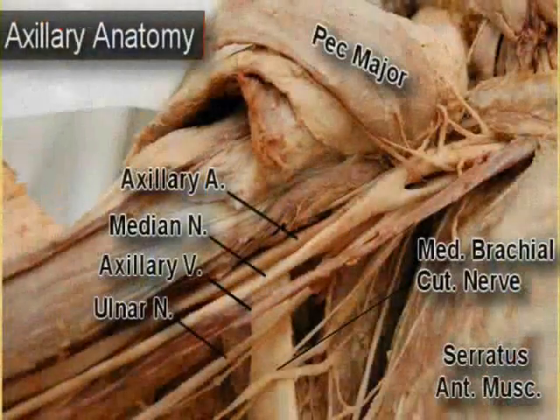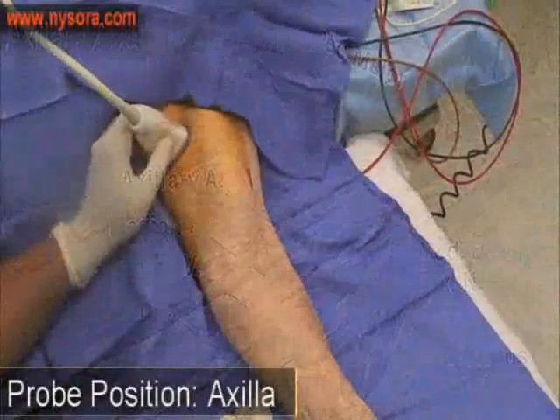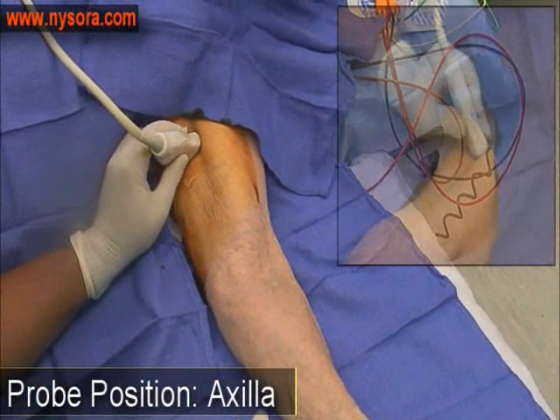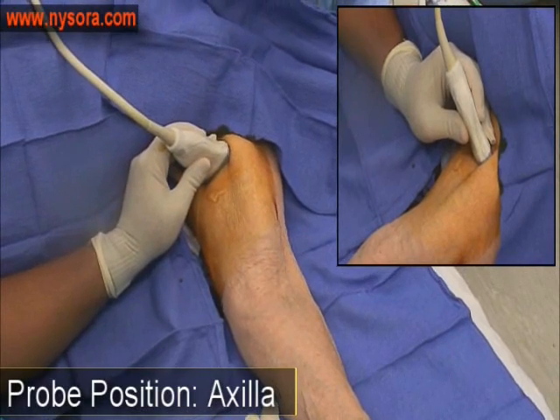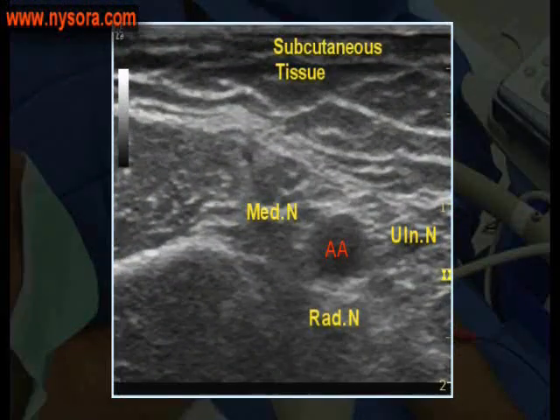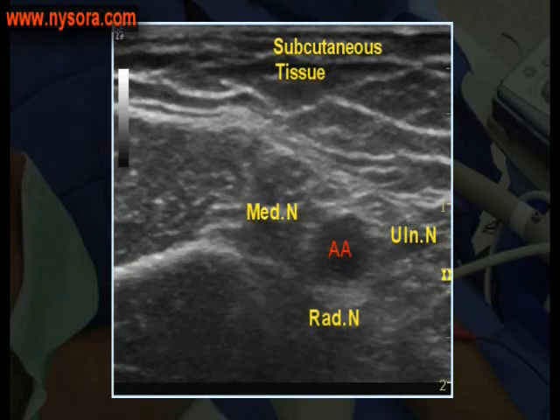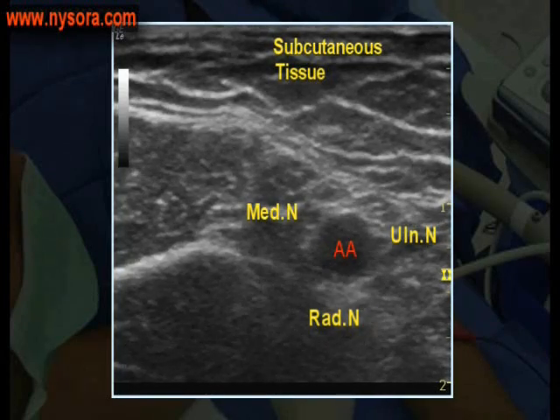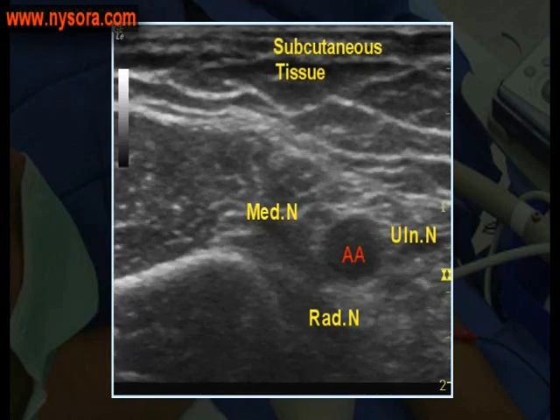This displays relevant anatomy of the axilla. The ultrasound transducer is placed transverse to the distal axilla and proximal arm. The axillary artery can be visualized in the middle of the screen with the nerves surrounding it.